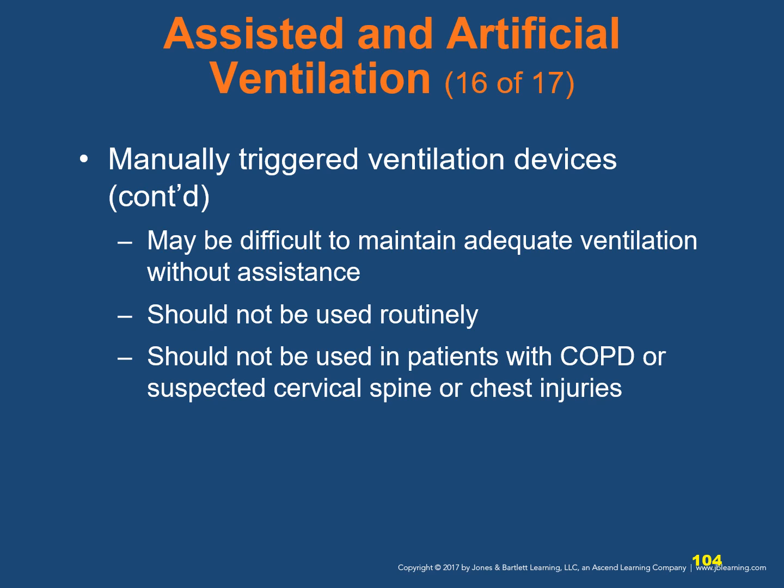As with a BVM, you must make sure there's an effective seal between the patient's face and the mask. The amount of pressure required varies according to patient size, lung volume, and lung condition. A COPD patient will need greater pressure, which is one reason that it's not really recommended, and pressures that are too great can also cause a pneumothorax.